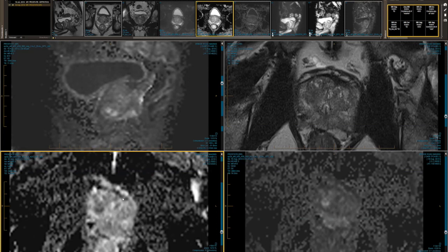It falls down in several areas, and for us, the biggest area that it falls down is that you should only use it for naive prostates, prior to the initial biopsy. And one of the reasons that we don't use it at UCH is because these sorts of cases form only a small percentage of the cases that we look at. And a lot of our cases are post-ablation cases for follow-up.